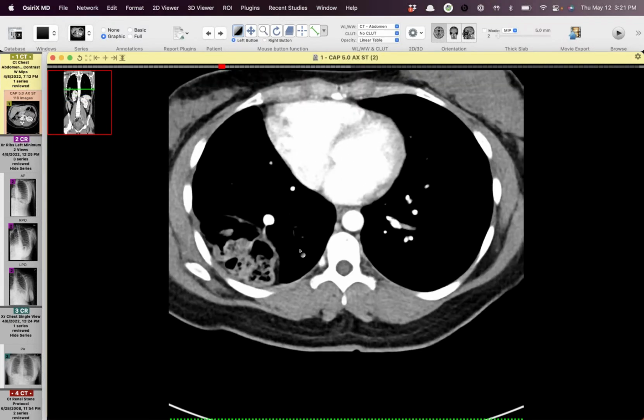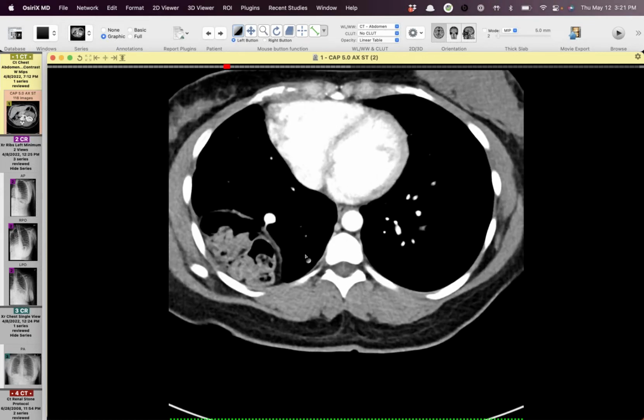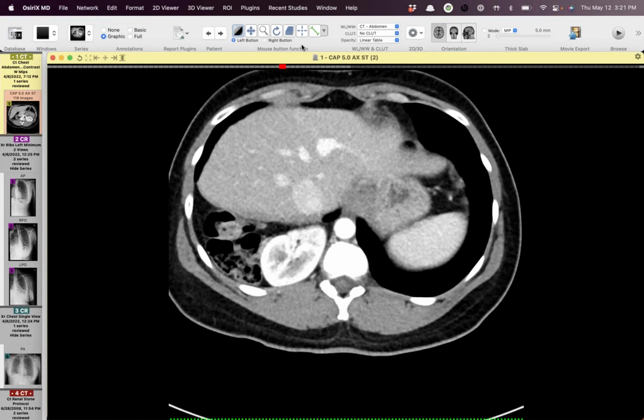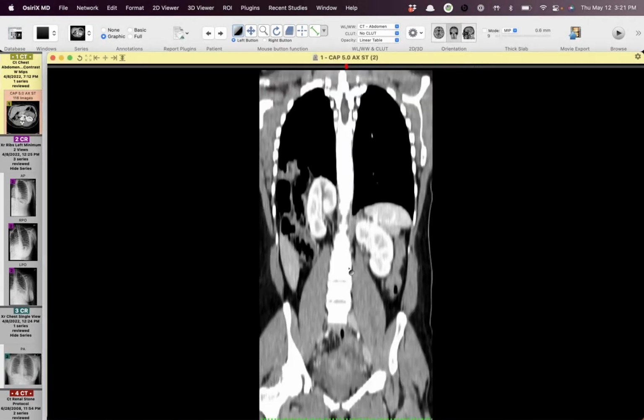Yeah, I think David shared a case that had an extra slip of diaphragm, and if I remember, that one was associated with the so-called horseshoe lung, which really isn't. But that's a tough one. I don't know, but diaphragmatic abnormalities are well described with scimitar. Coronal would be typical Bochdalek, though. Yeah, can you show us a?